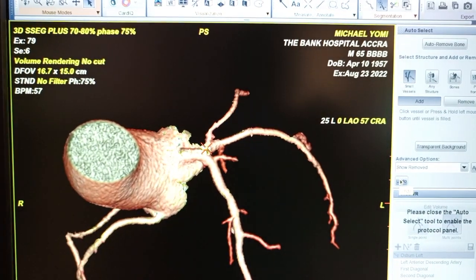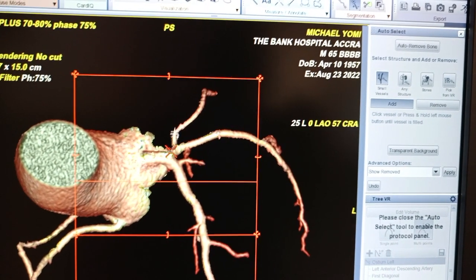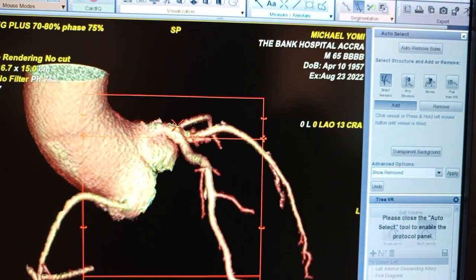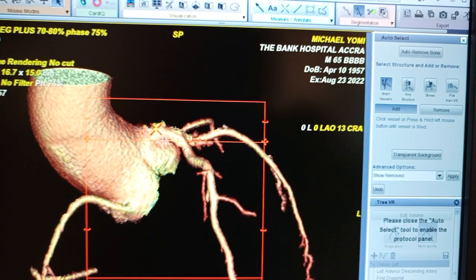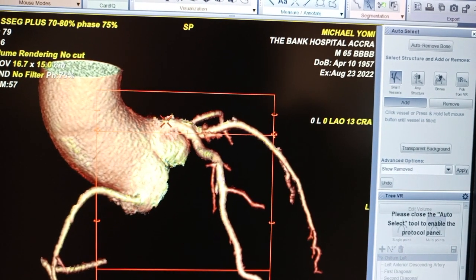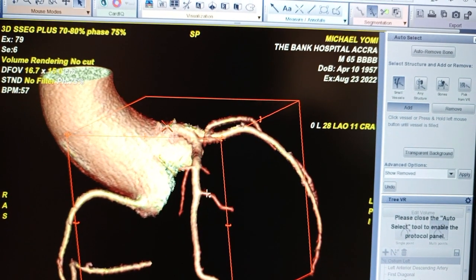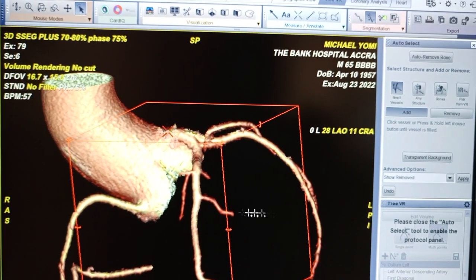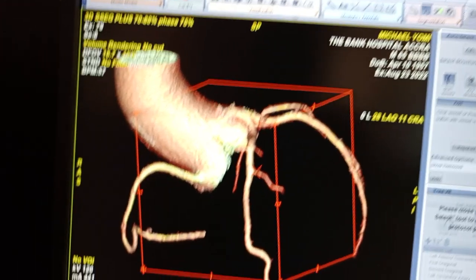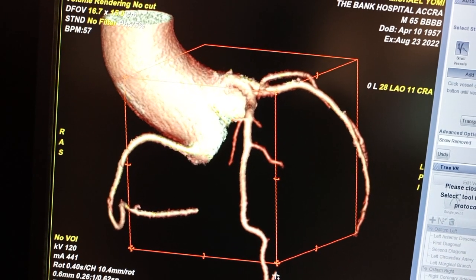If you think it's gone too far, you just go to Undo and it will undo everything for you. This looks perfect — so that is the left side. We have the left anterior descending with its branches. Let's see if we can grow it further — it ends there. Let's see if it can grow further.